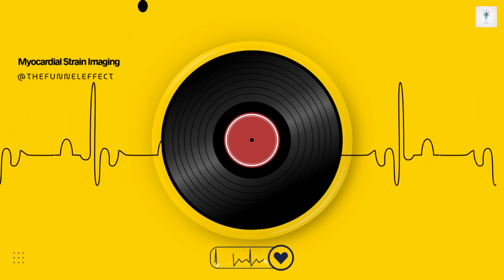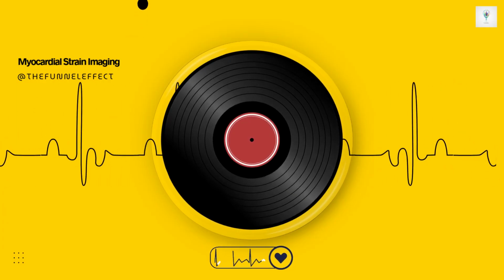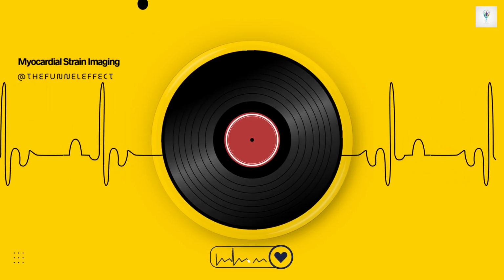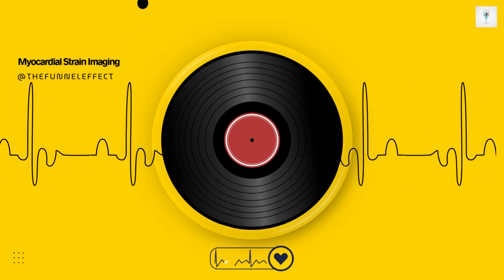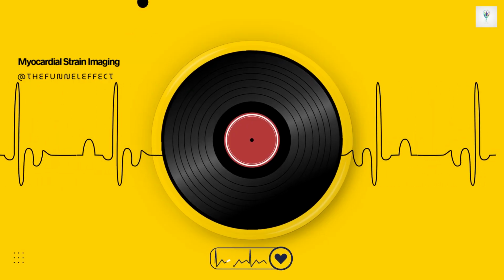And for arrhythmogenic RV cardiomyopathy, ARVC, which primarily affects the right ventricle, strain must be crucial there too. Absolutely essential, because RV dysfunction is the hallmark, but conventional measures often fail early on. Abnormal RV strain, particularly RV free wall strain, is often one of the very earliest detectable signs of ARVC. Even before symptoms?